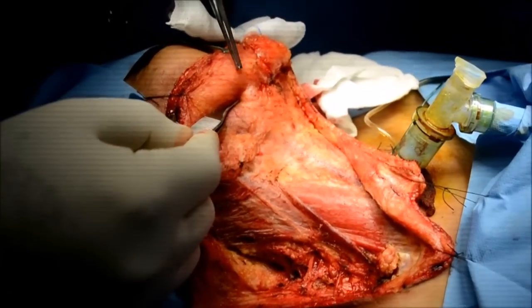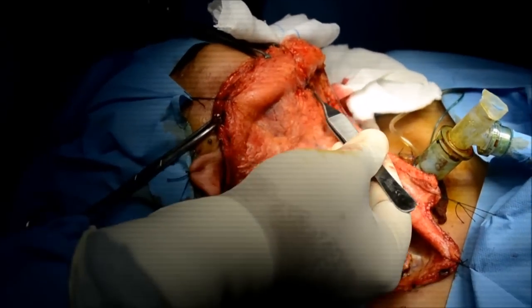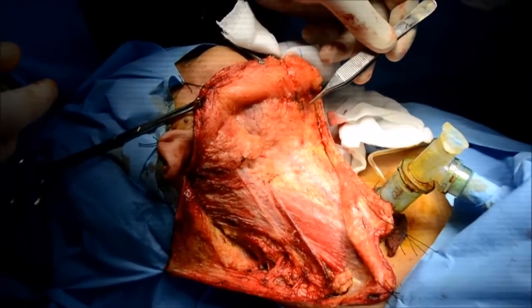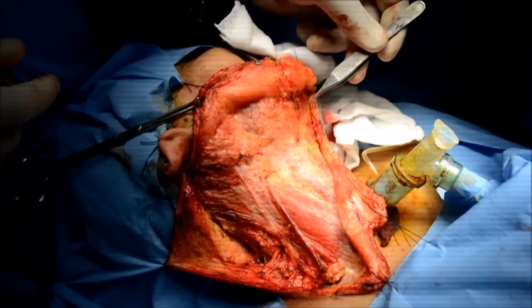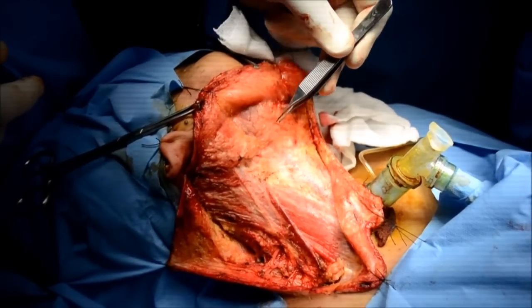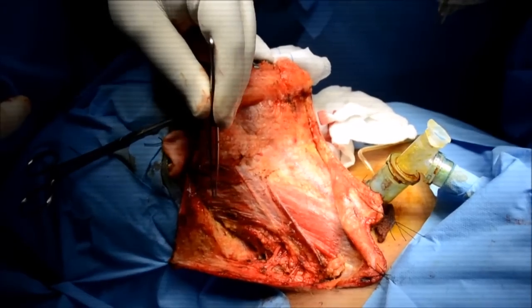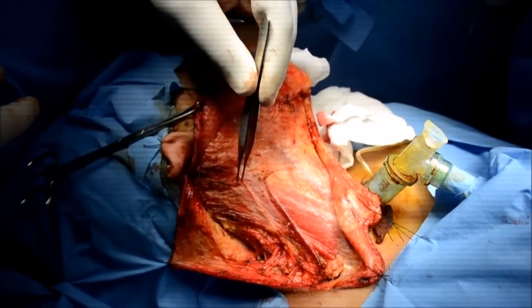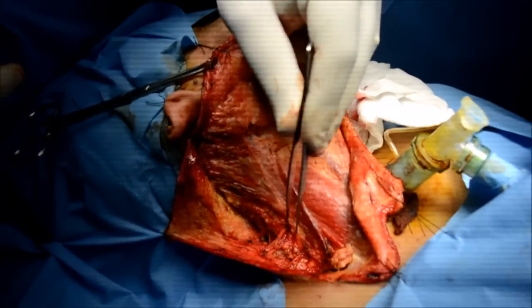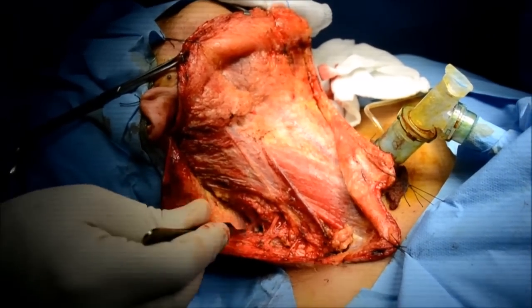The superior flap is stitched up and the anteriormost boundary is the digastric on the opposite side. You would sometimes faintly see the marginal nerve, and that's the tail of the parotid, sternocleidomastoid muscle, greater auricular nerve, and external jugular vein. Once you have completely delineated the anatomy, the neck dissection starts.